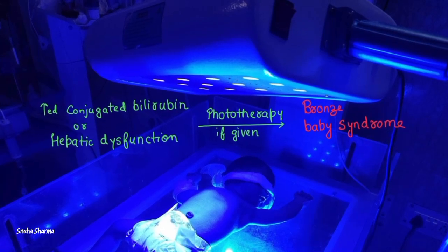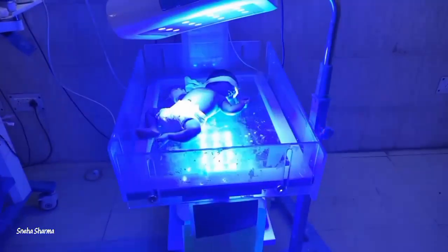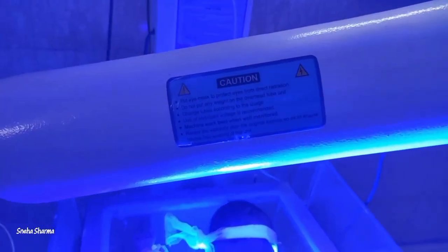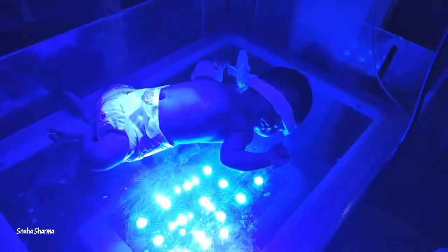Now, the benefits of phototherapy are faster bilirubin reduction, reduced treatment time, and improved safety. And the complications are hyperthermia, retinal damage, bronze baby syndrome, dehydration, hyperpigmentation, and hypopigmentation.